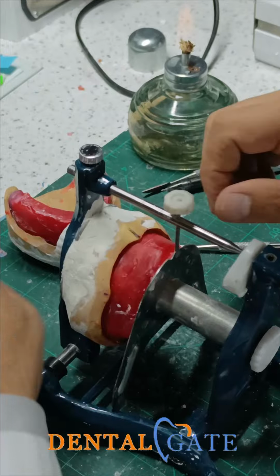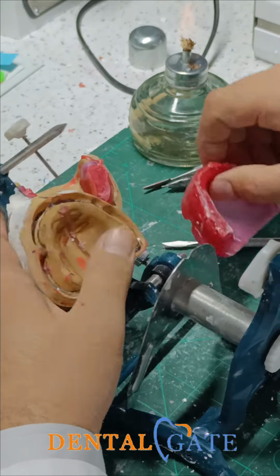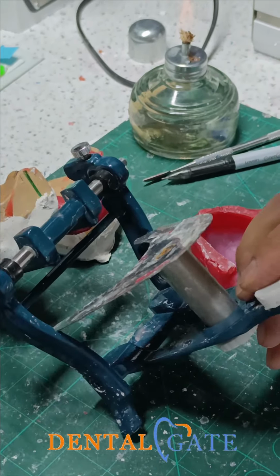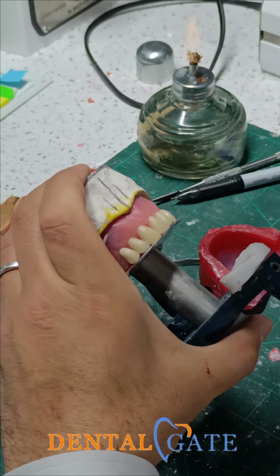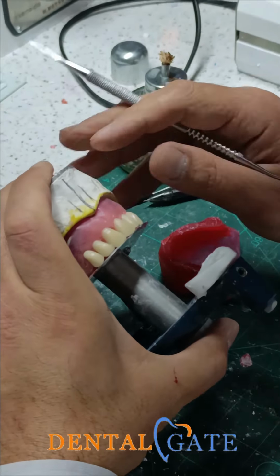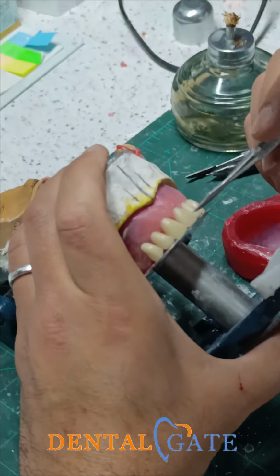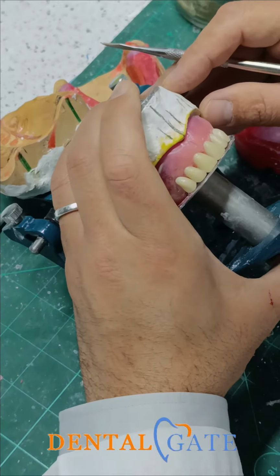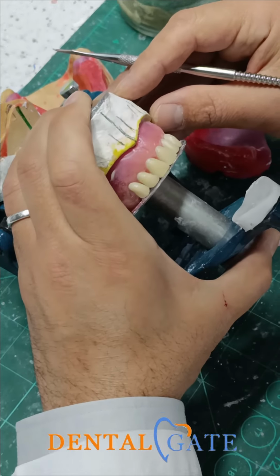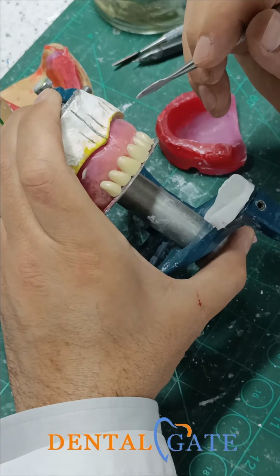So regarding the upper teeth, our objective is to make this arrangement here. You can see the central incisor and lateral as well as the canine. What's the criteria that will be followed in the arrangement?